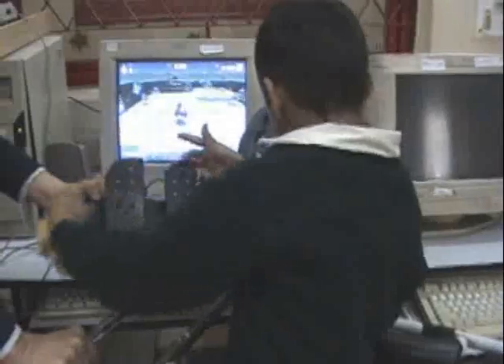My name is Arun Mehta, and my effort has been to try and help Arpit communicate through the computer in some other way. What works in our favor is how obviously interested Arpit is in learning how to use a computer.